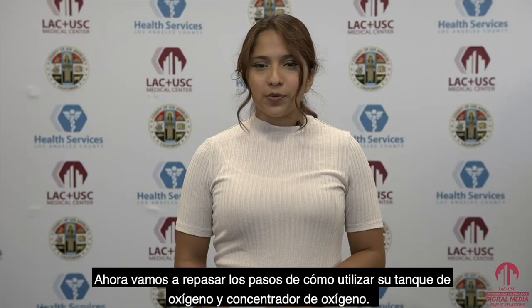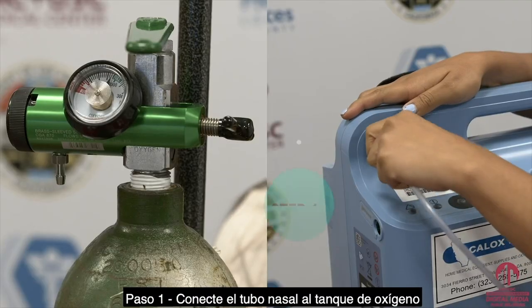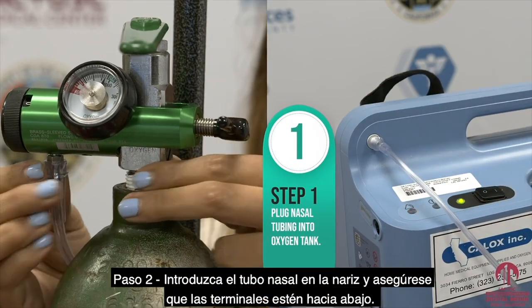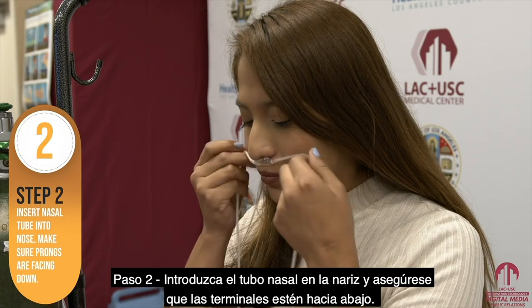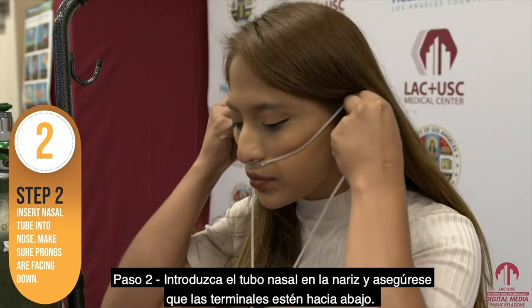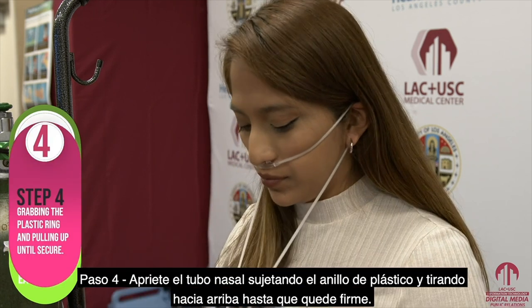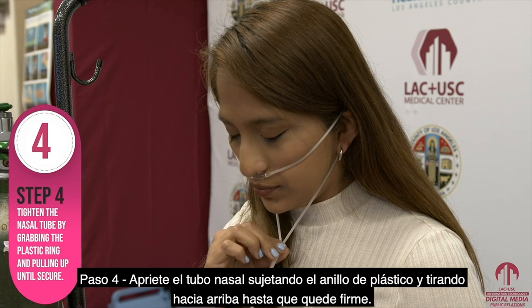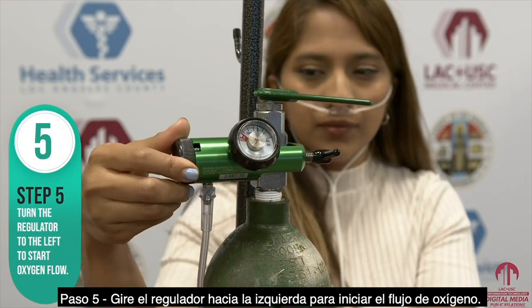Now let's go over the steps on how to use your oxygen tank and oxygen concentrator. Step one: plug the nasal tube into the oxygen tank. Step two: grab the nasal tube and insert the prongs into your nose — make sure that the prongs are facing downward. Step three: wrap the nasal tubing around each ear. Step four: tighten the tube by grabbing the plastic ring and pulling it upward until it feels secure. Step five: turn the regulator to the left and begin oxygen flow.